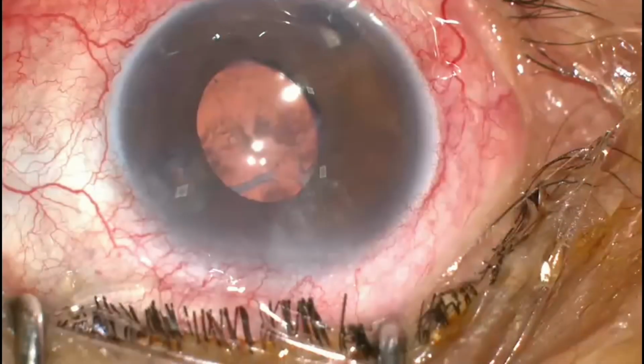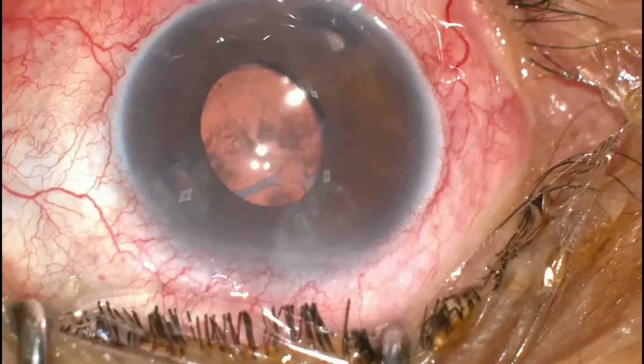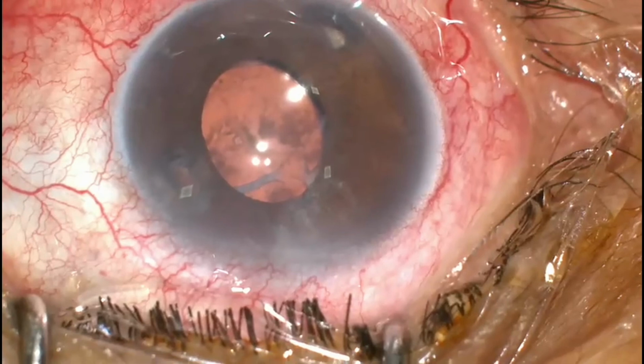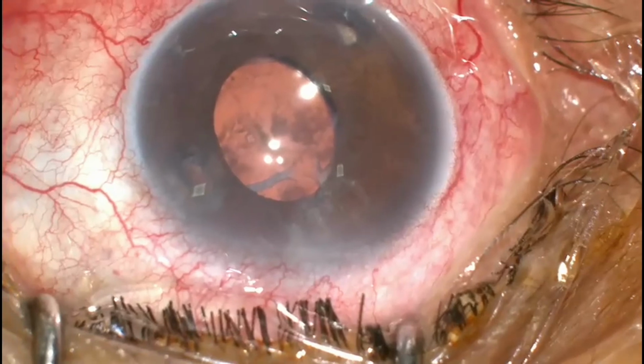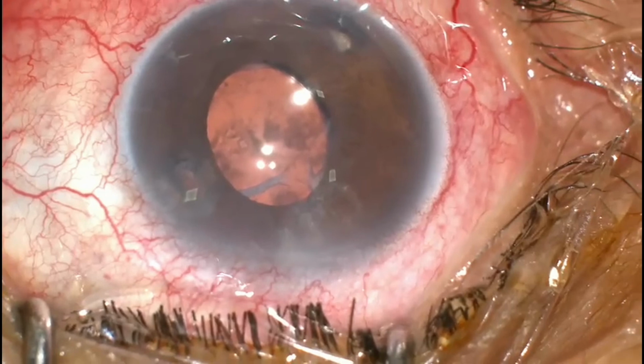In this case, we'll be seeing how to do a PDEK in an ICE syndrome patient. So this patient was operated elsewhere, cataract surgery done a couple of years back, and presented to us with a corneal decompensation. And we decided to go ahead with a PDEK.